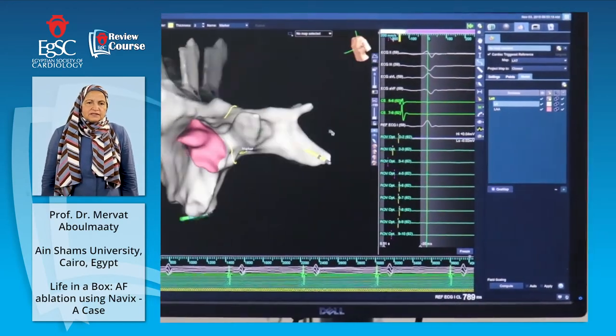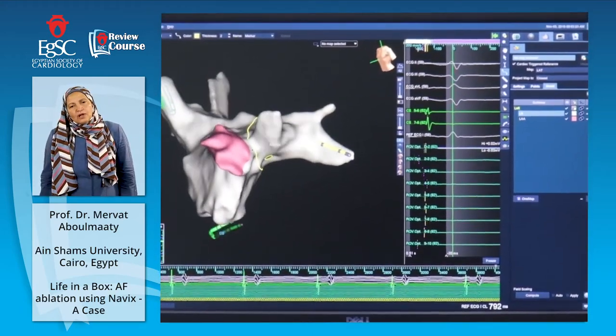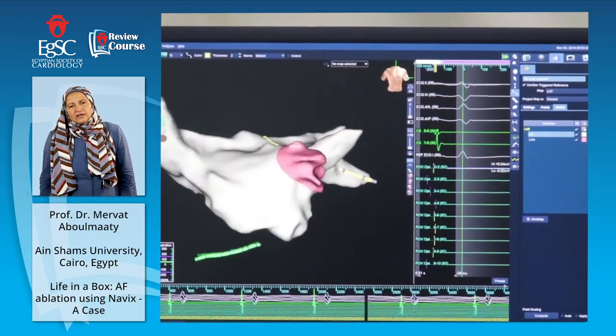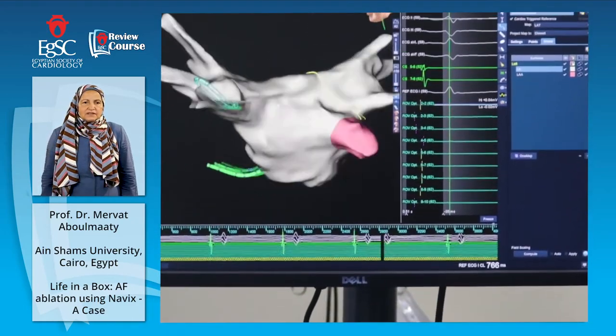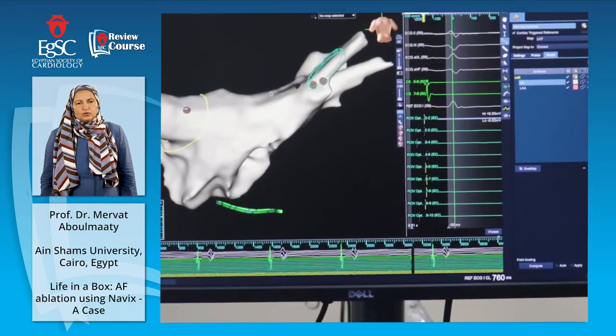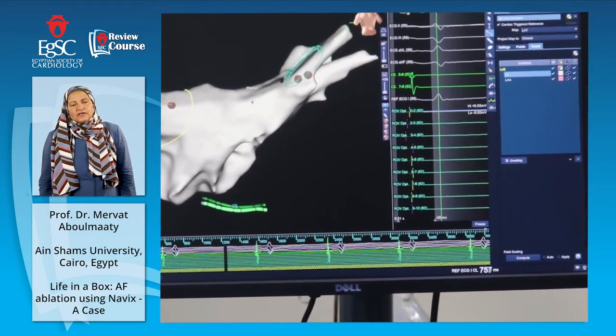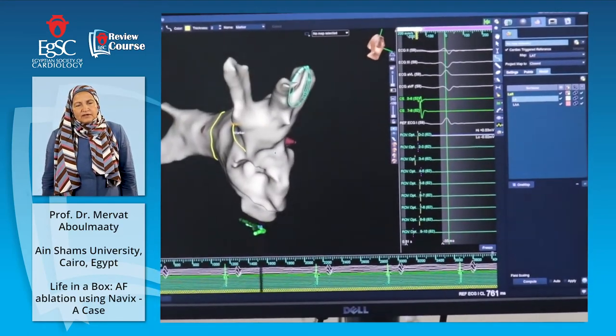The pink part, this is the appendage. And these are the lines we draw on the left-sided veins, outside the ostium. The dots I'm seeing are the ostial points. I go behind it because we want to do WACA, wide area of circumferential ablation. Yes, I'm here doing the right-sided veins.